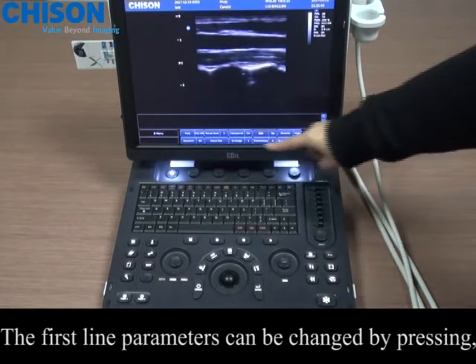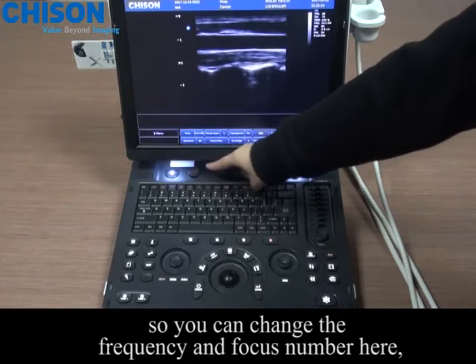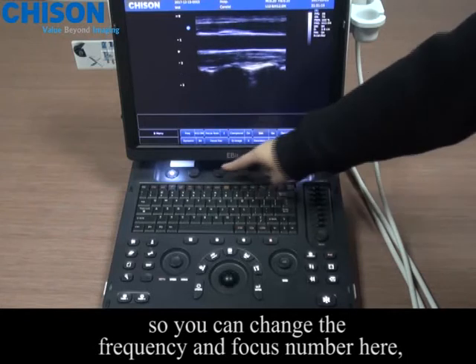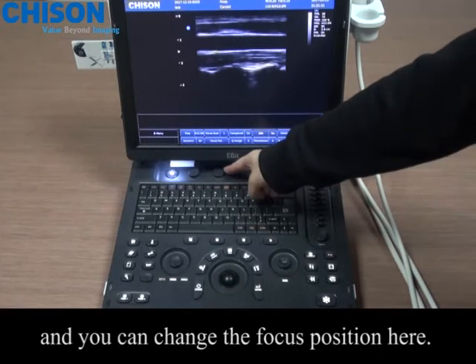The first line parameters can be changed by pressing. So you can change the frequency and the focus number here. And the second line can be changed by twisting. And you can change the focus position here.